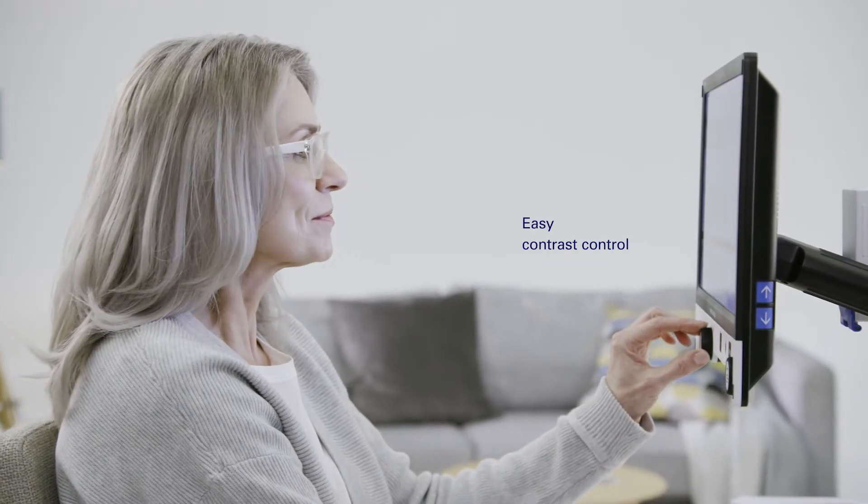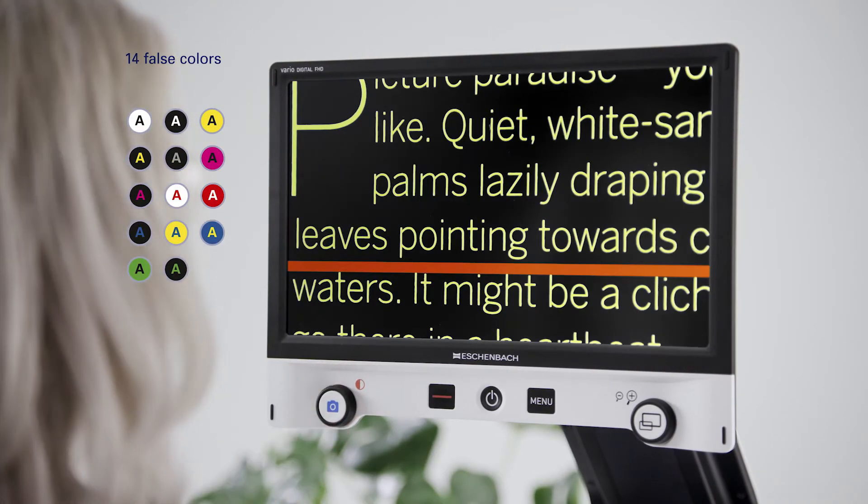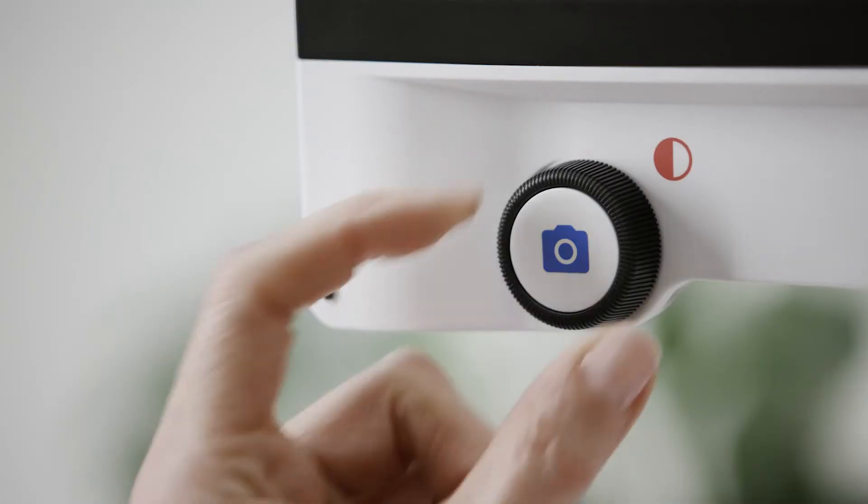In order to increase the contrast of the displayed texts, there are 14 false color combinations which can be easily selected via a rotary knob.